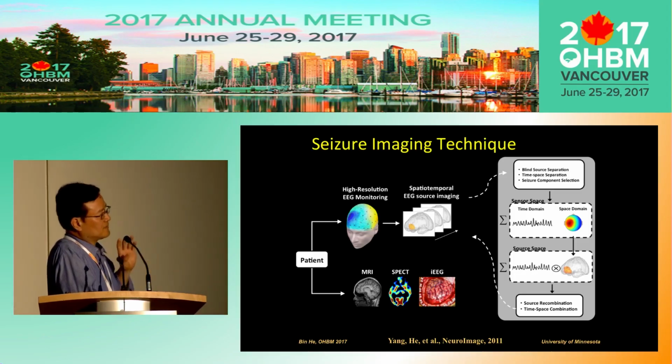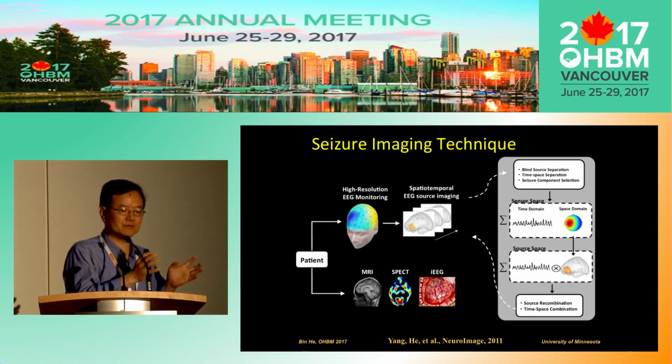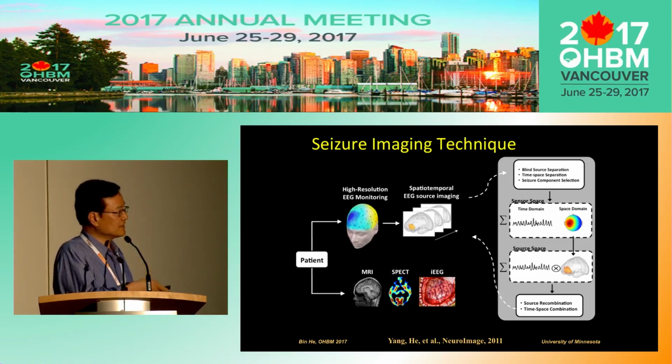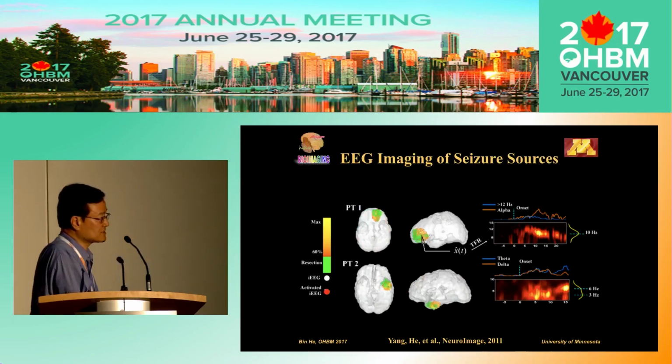My own group has been working on this problem with one particular technology approach, which we are quite happy with. In this case we introduce one specific application of ICA. First, we decompose the EEG data into multiple ICs, and then we introduce something called a recombination approach to get a single spatial-temporal dynamic source map. And here are some of the results.